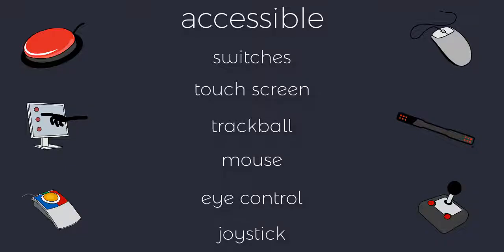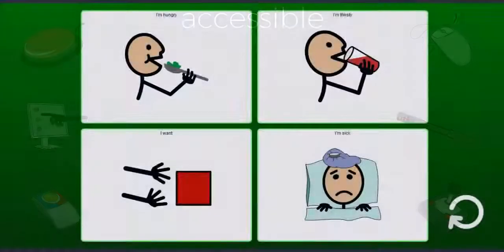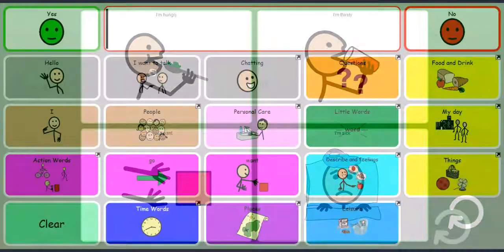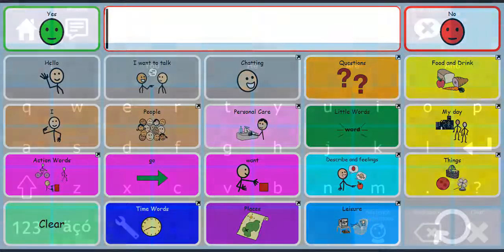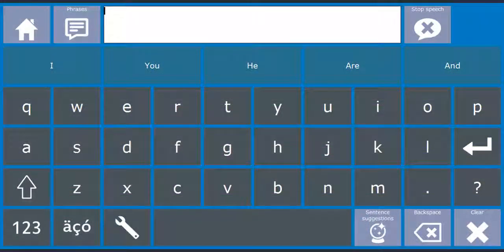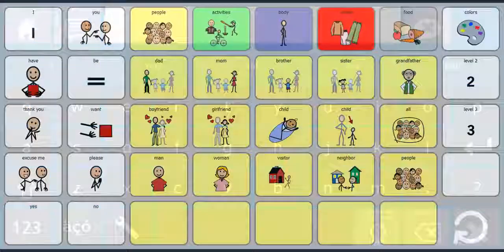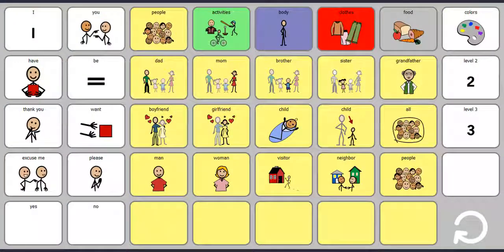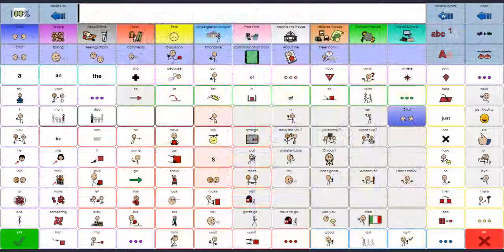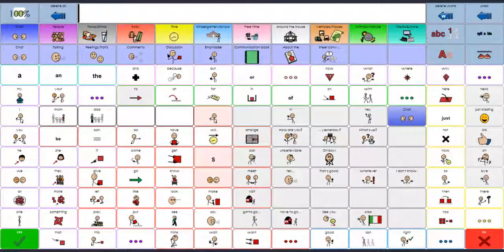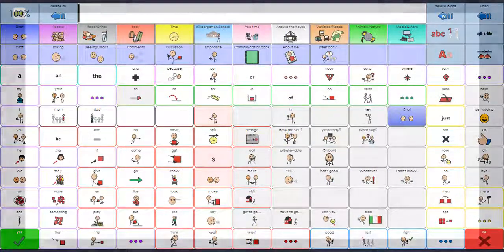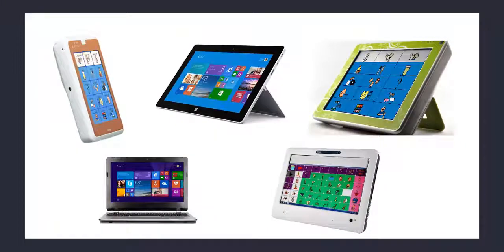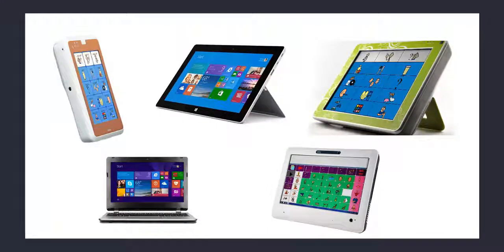The software offers numerous pre-made vocabulary sets that can be used right out of the box or easily adapted and extended for specific individual needs. MindExpress runs on Windows computers and tablets or on dedicated AAC devices.